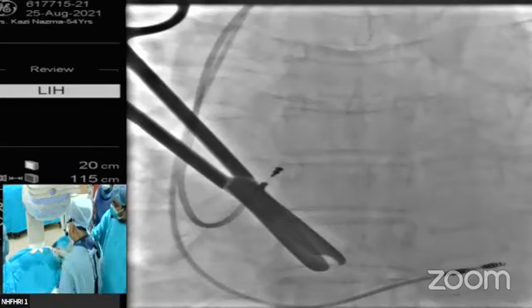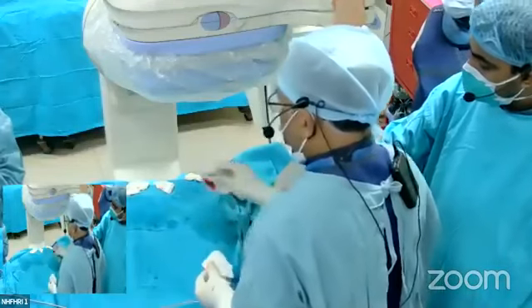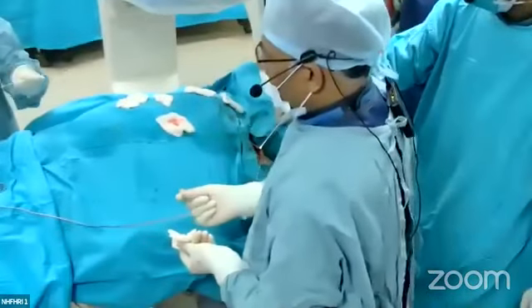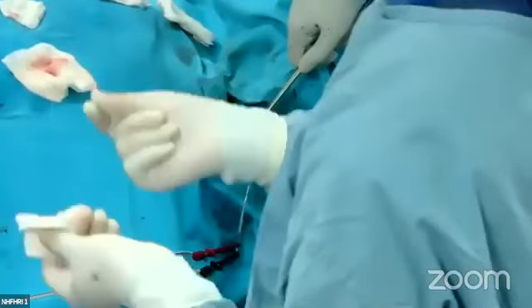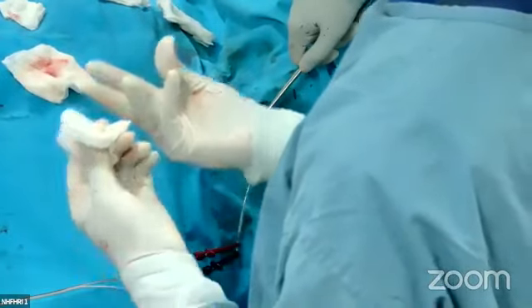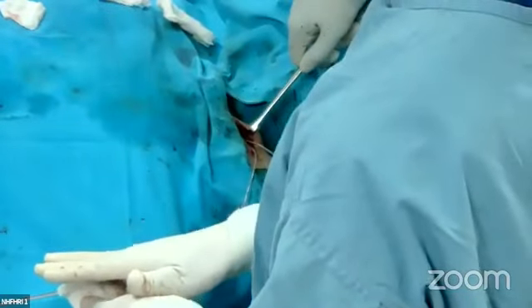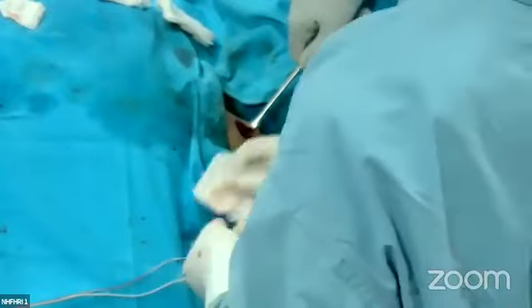But the problem is hemorrhage, but the more late complication that happens is pocket infection, because of hematoma. More hematoma immediately may be healed, but that is the nidus for infection. The patient may come after 3 or 4 months with pocket infection. So hematoma may be reduced by compression, but it will invite infection. So that is more dreadful.